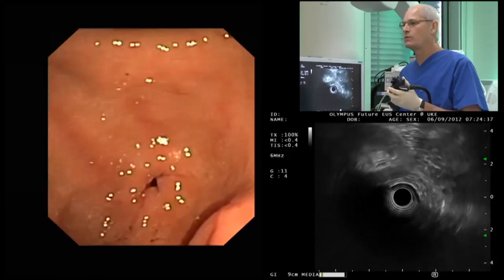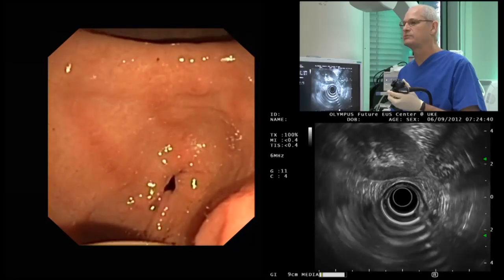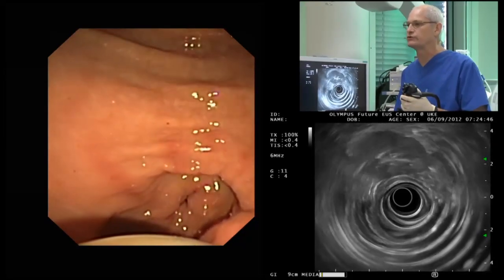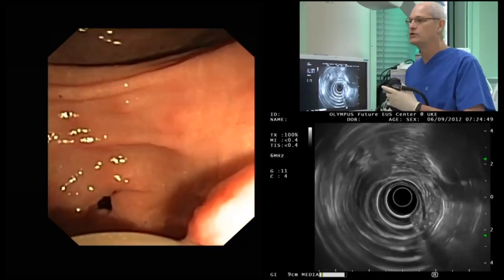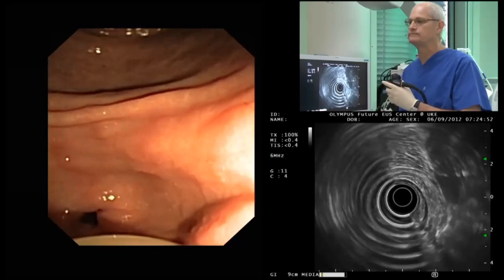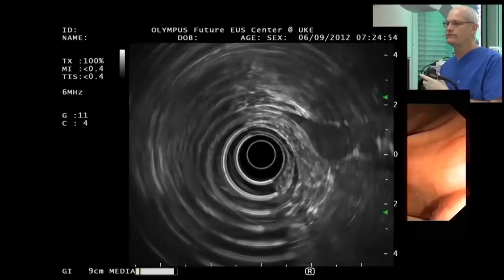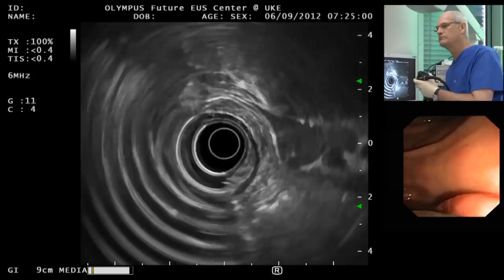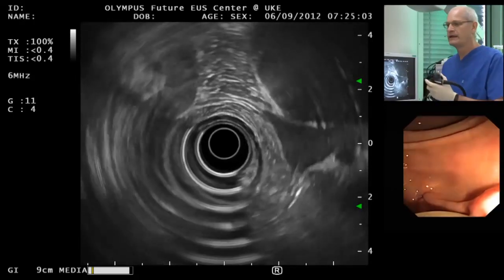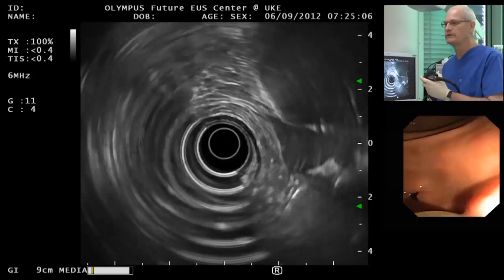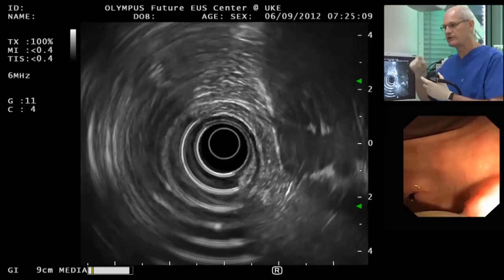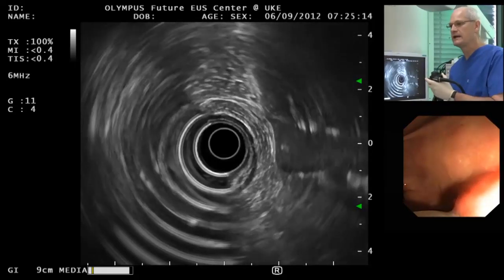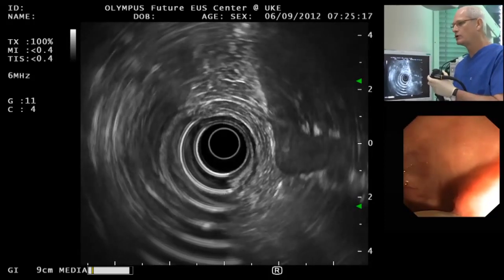I generally like to inflate the balloon a little bit — the main reason is that it shows me where the transducer is. Then you can move the transducer right against the lesion. Once you think it's against the lesion, torquing to the right moves the transducer toward the lesion. That helps me determine exactly where the lesion is on the 360-degree ultrasound image. If I torque right, I go into the lesion.